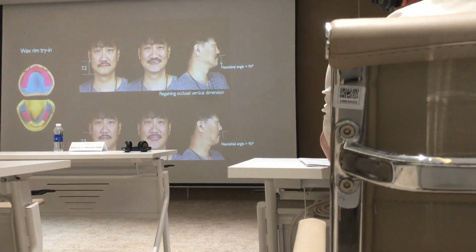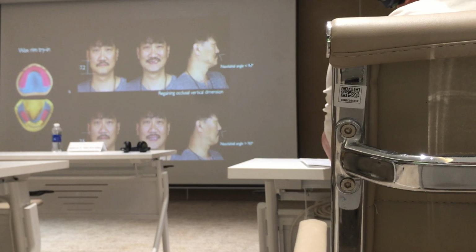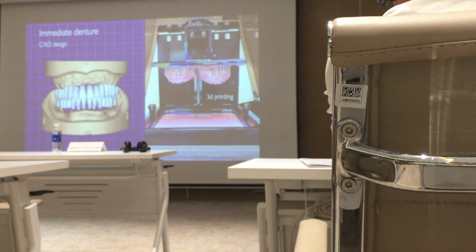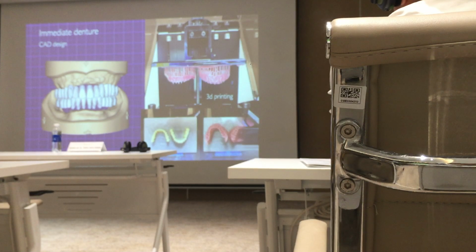device, so we do have a better nasolabial angle and better aesthetics of the lip support. So I scan these models with my desktop scanner, and then I converted the actual stone cast into the virtual working cast. So we just do the digital workflow. We plan to make immediate denture that will be delivered right after the extraction.